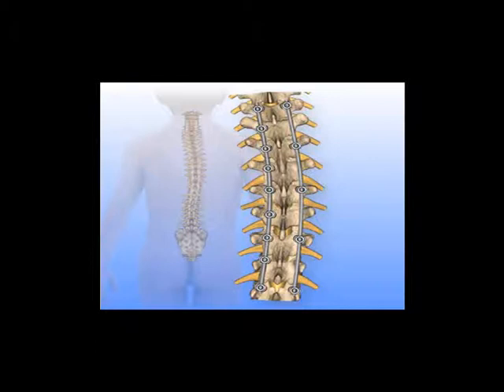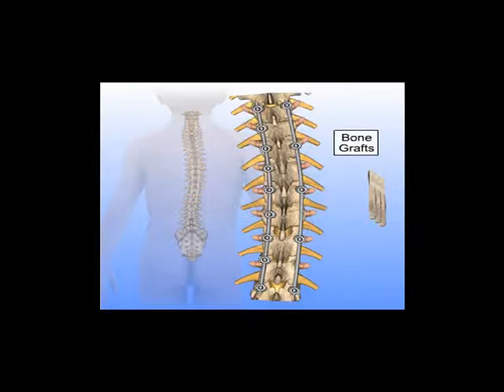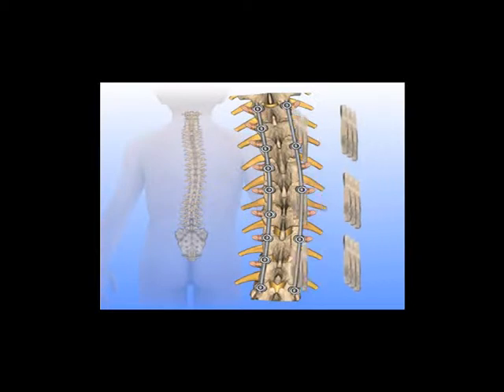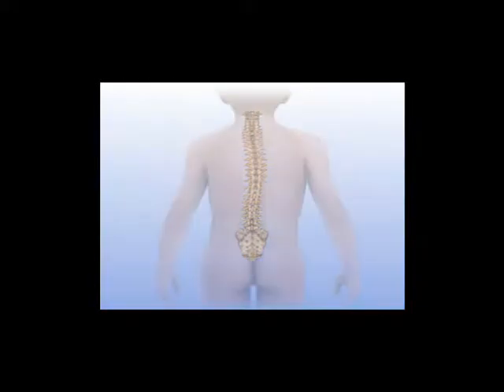Bone grafting can be done with pieces of a patient's own bone, processed bone from a bone bank, or a bone graft substitute. To harvest a patient's own bone for grafting, a second incision is made over the back of the pelvis. Bone is removed from the iliac crest and placed along the prepared sites on the spine where the top layer of bone was removed for the fusion. The bone grafts eventually grow in place, fusing the spine and providing stability.